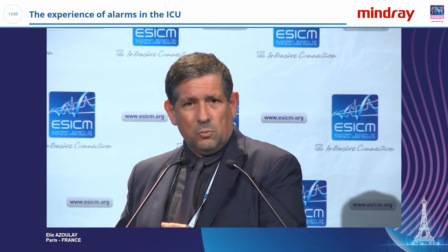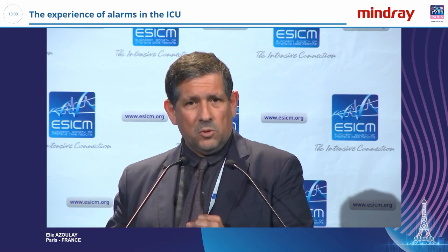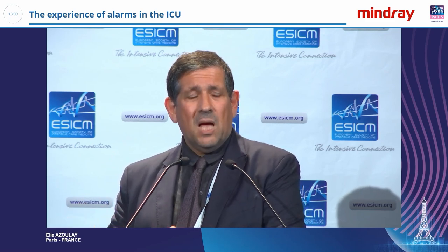And sometimes you have 2 patients, and there are alarms in the 2 rooms. So someone is with one patient, but there is an alarm elsewhere. The problem is not the amount. At a patient level, the problem is there are so many alarms for one patient that sometimes you miss the appropriate one that would harm the patient. So for this, I don't think that there's a local protocol that would bring back safety to the patient. We need to get beyond that, and we look forward to data.